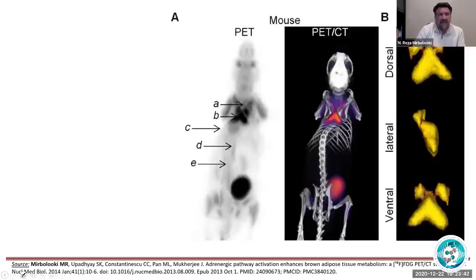So we chose to compare IBAT uptake from this point when we do mice because of its more consistent shape. It was really easy to just draw an ROI around it. So for that reason, we just moved to comparing IBATs between different groups rather than getting different parts. Although you can see some peri-aortic or other places like cervical, it will be difficult to draw an ROI around them.